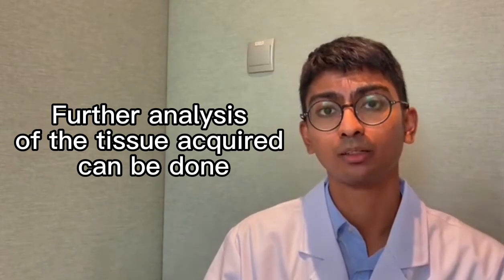Once acquired, we can even do further analysis of the acquired embryo and fetal tissue and do some study to find out what is the cause of miscarriage. For example, it could be due to fetal chromosomal instability or abnormality, or maybe it could be a nutritional deficiency. All of this because of how hysteroscopy accurately and wholly removes the pregnancy tissue. It allows us to do further analysis in the lab.